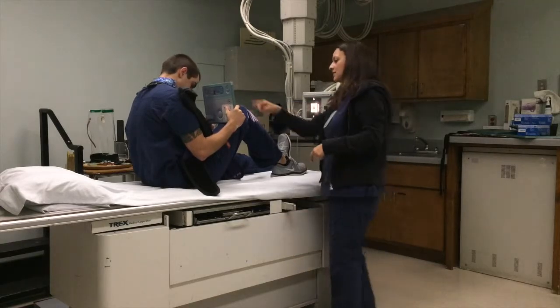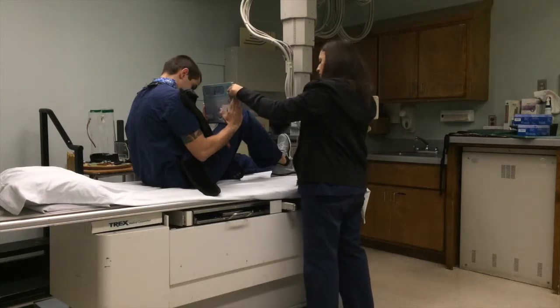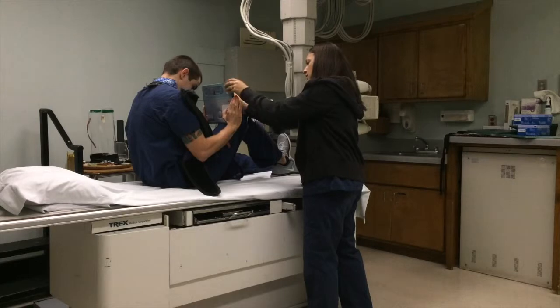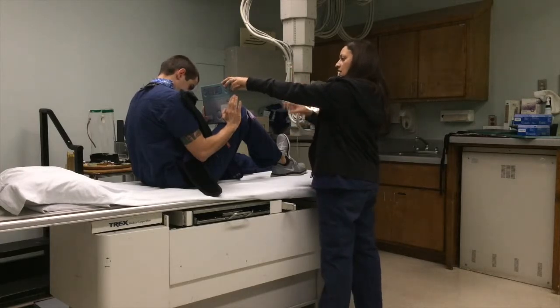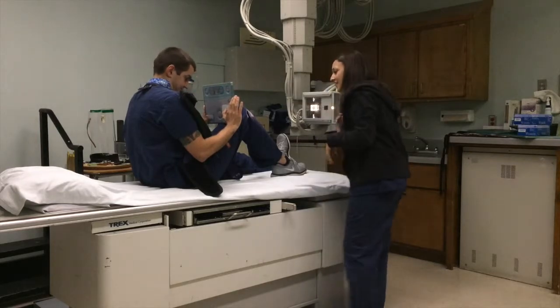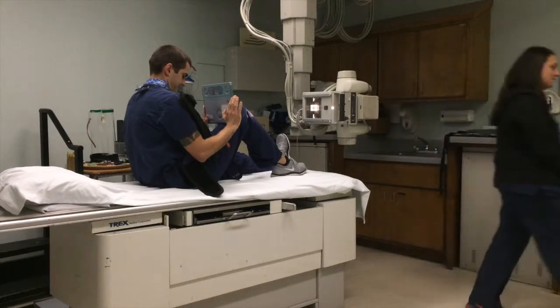That looks great. I see perfectly. I'm going to move his fingers just a little bit. Thank you. You've been so helpful. Let's go right. Make sure I'm not overexposing unnecessarily towards his face. And that looks great. So I'm going to go ahead and shoot that at 70 at 4.